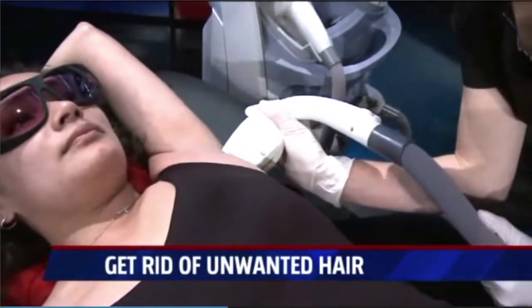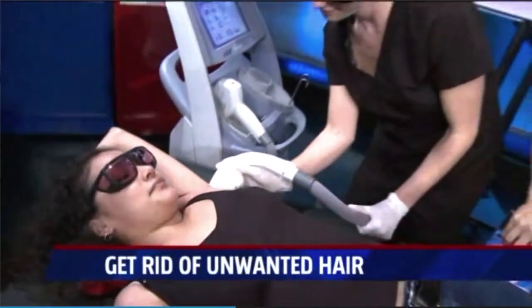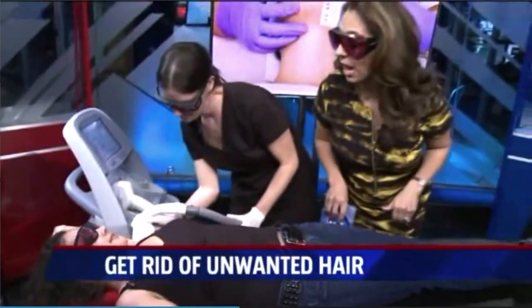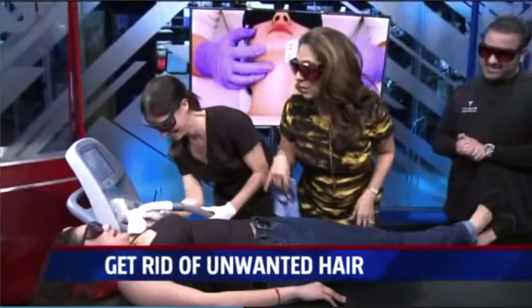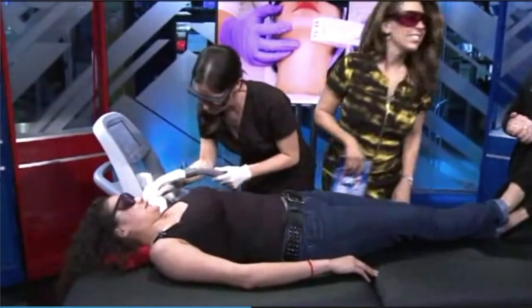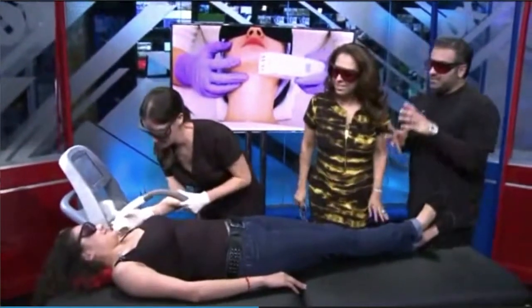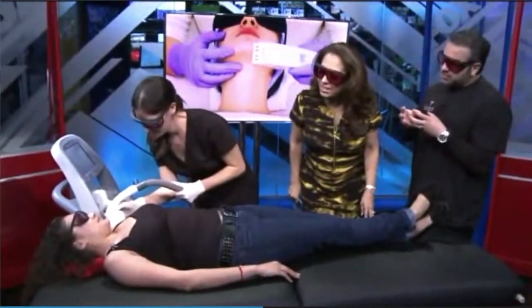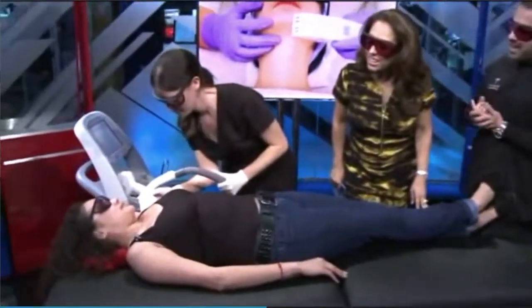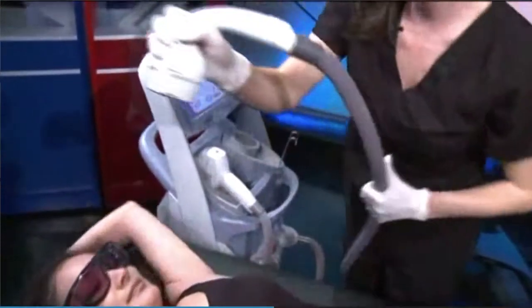Okay, I want to ask one more question, but I want to check in with you because I've had laser hair removal done and I've wanted to jump off the table and hide out of pain. Do you feel that right now? No, I don't feel anything at all. At all? At all, no. Are you serious? It's amazing. So what this laser is doing, it's suctioning the skin into the machine, which diminishes the pain. And then it picks up the melanin in the hair and eliminates that hair.